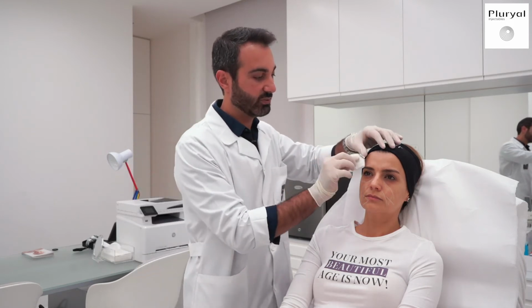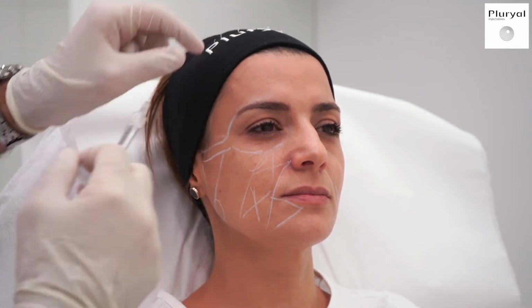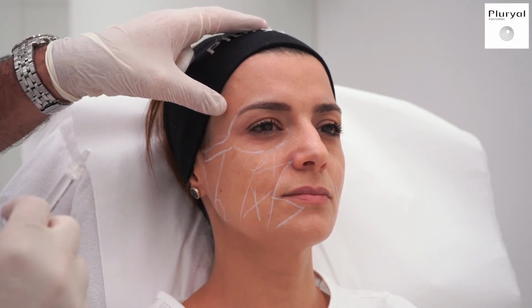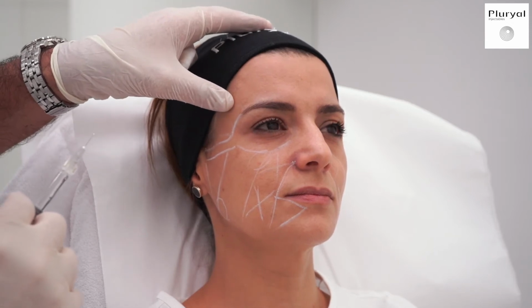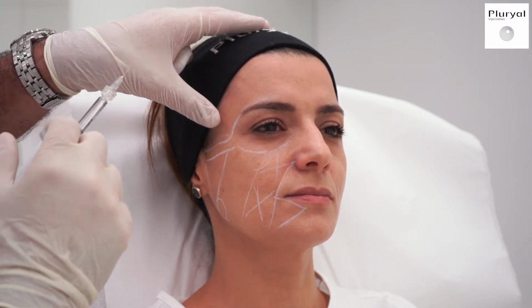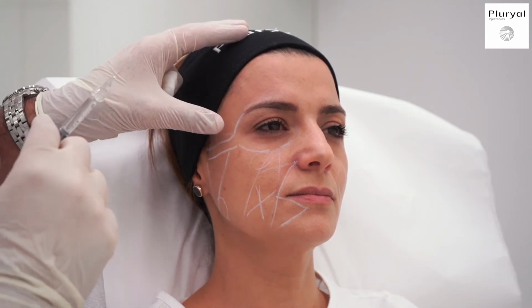We always start with disinfecting the area. The technique I use is I always palpate the temporal crest, and here I have already marked the orbital rim. What I do is I go laterally 1 centimeter and upwards 1 centimeter. You can sometimes see the veins that are superficial, and you have to avoid them when you inject. If you see there is a vein passing in this point, you can just take the skin to the side laterally or medially, just to not go through the vein.